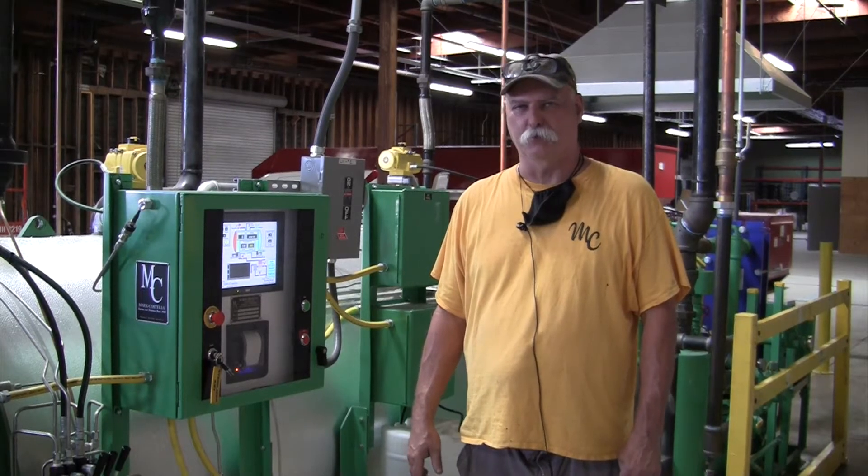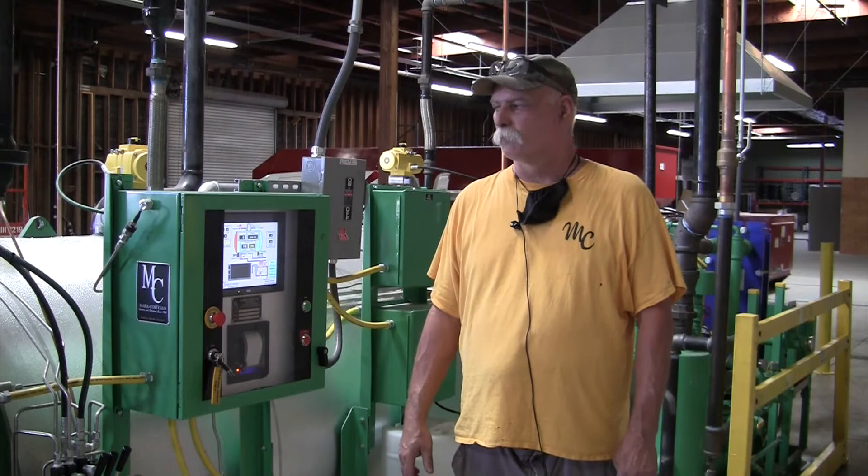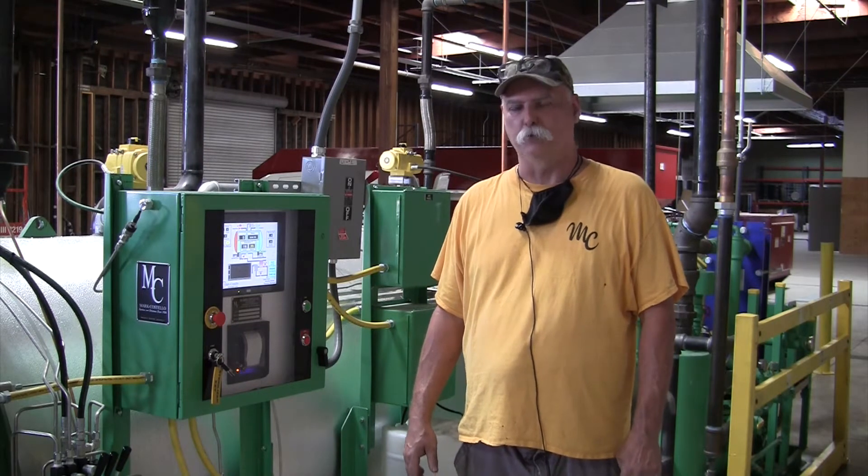Hi, I'm Corey Swang, Mark Costello Company Service Manager. Today we're going to demonstrate how to run the Mark Costello Sterilizer.